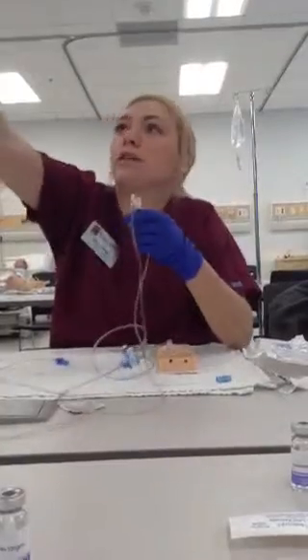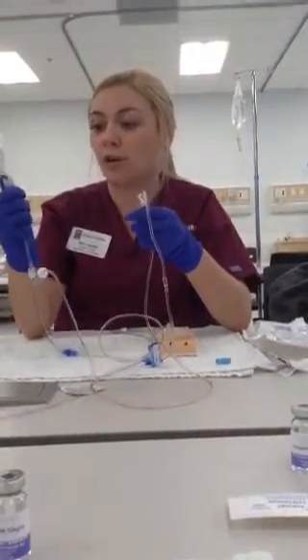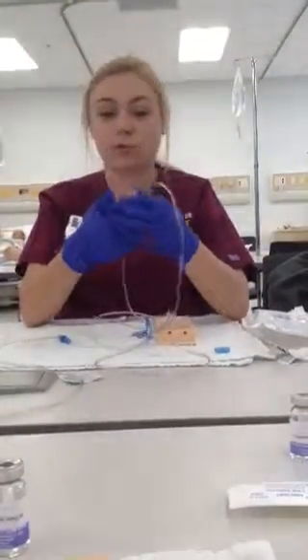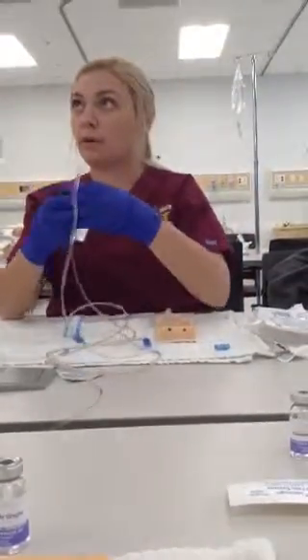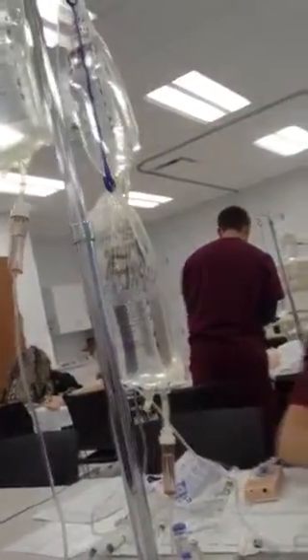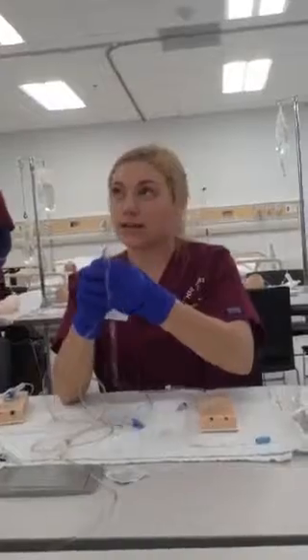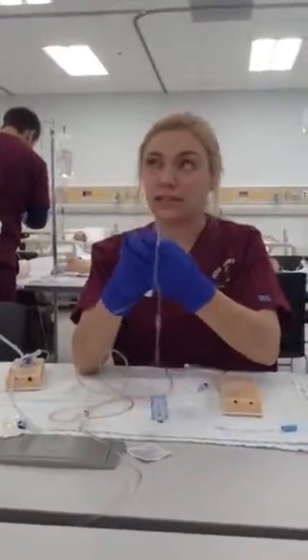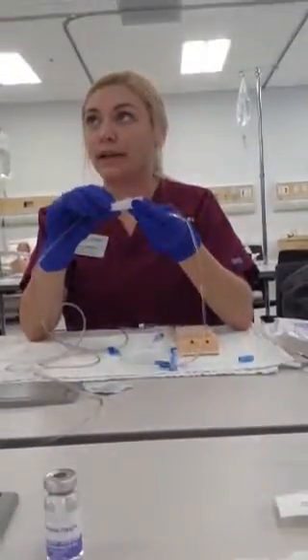So I'm going to go ahead and open up the clamp on my IV medication all the way, and then set my drip rate based on the primary tubing. So I'm going to watch this flow. Catheter is like not in there, so I got to make sure it's actually dripping. Okay, so I'm going to want to make sure that it has 4 drips every 15 seconds. So I'm going to go ahead and watch that and adjust my clamp as needed.